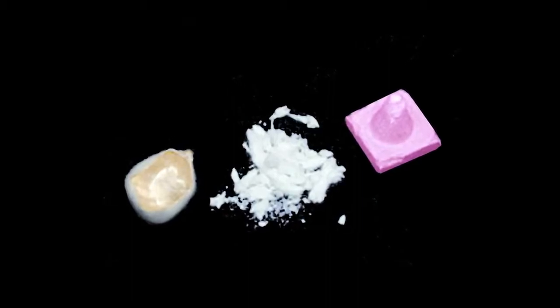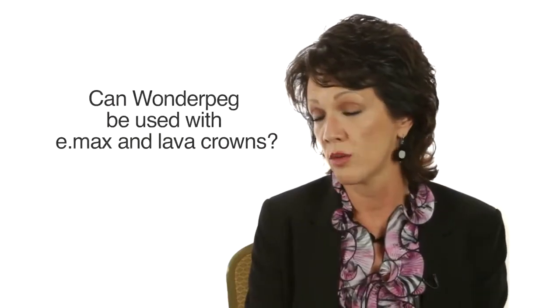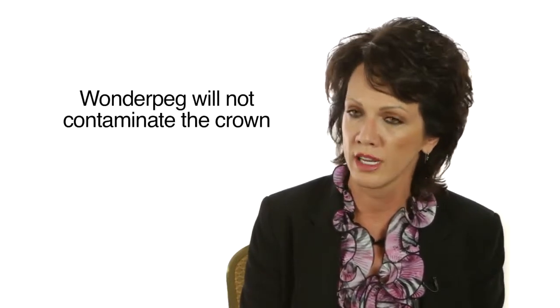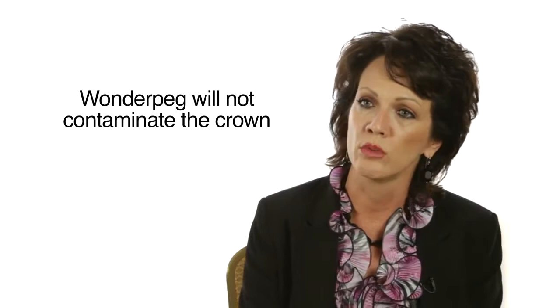You don't have to blow it out or do anything like that and it's non-contaminating. One of the questions that we're often asked is can Wonder Peg be used with Emax and Lava crowns? And the answer to that question is yes it can, and it will not contaminate the crown and it will not stain the Emax or Lava crowns.